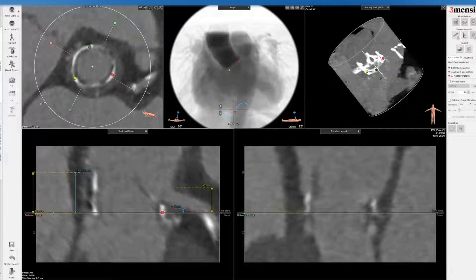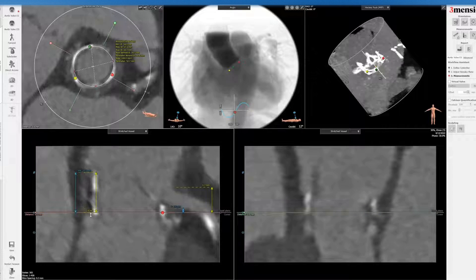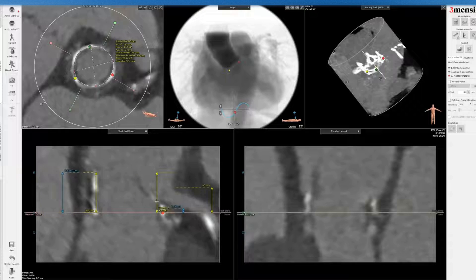I'm doing a custom length measurement down to the annulus. The height of the Trifecta valve is taller, but we're measuring right around the valve frame at the bottom rather than going below that. This valve will be receiving either a 20 millimeter balloon-expandable valve or a 23 millimeter self-expanding valve. The leaflets on the frame will expand outward in the outflow. So placing around 20 millimeters is approximately what it might expand to.